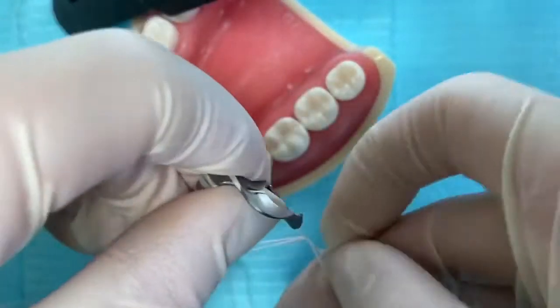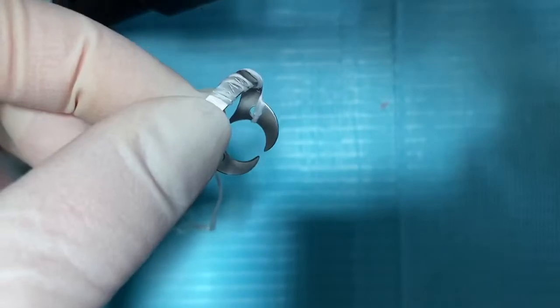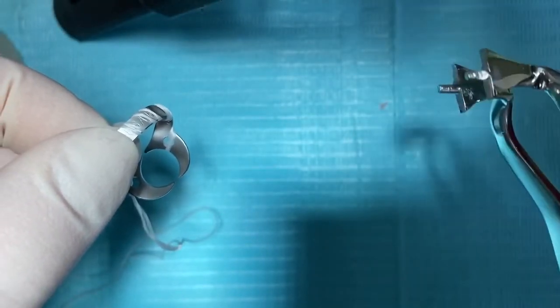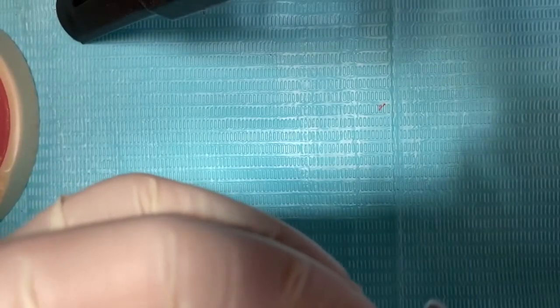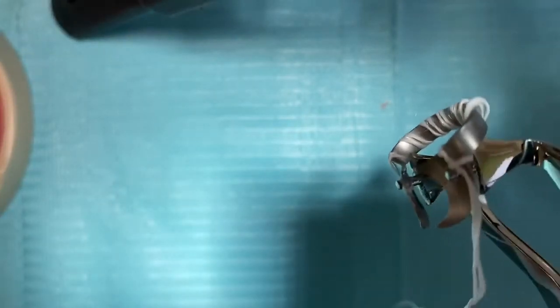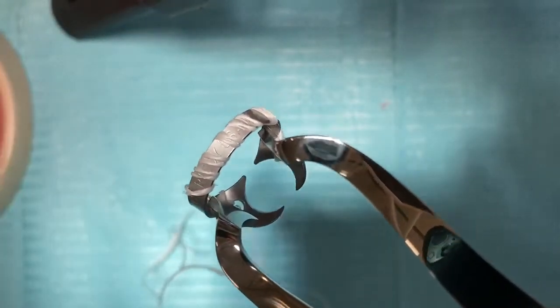This is how it looks once we've ligated the clamps and made sure the dental floss goes all around them — we're good to go. We're going to use the rubber dam clamp forceps to hold the clamps. The two prongs should fit inside the holes in the jaw. Once fitted inside, you can make the clamp bigger by pressing on the handles, or release to make it smaller.